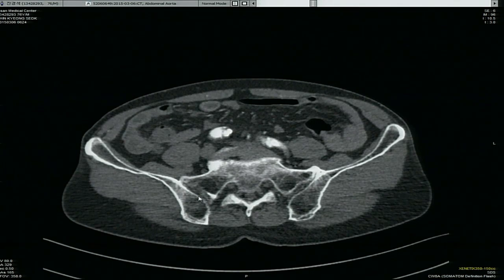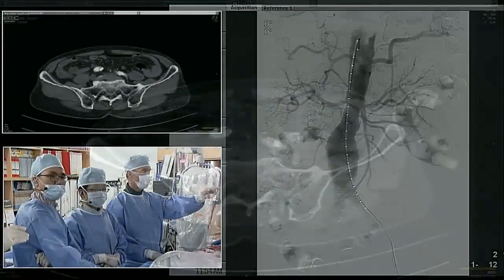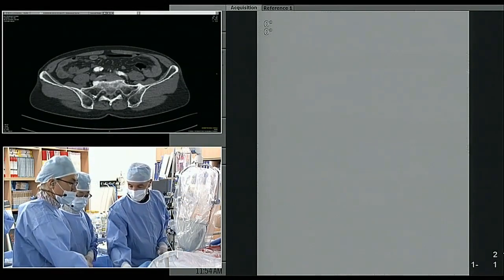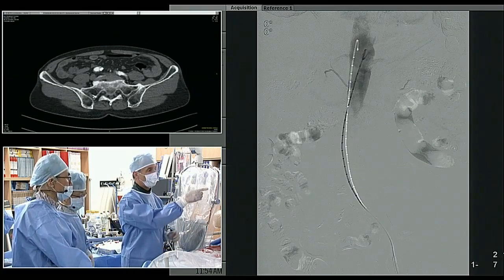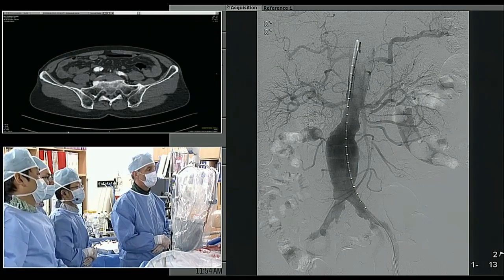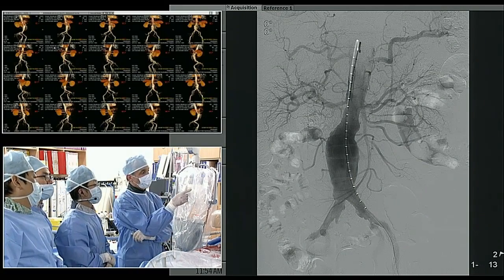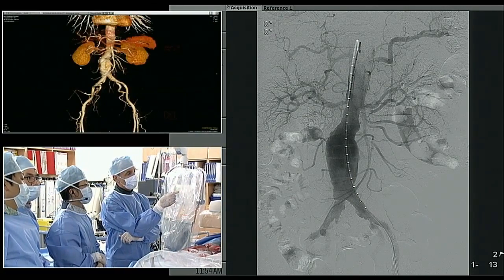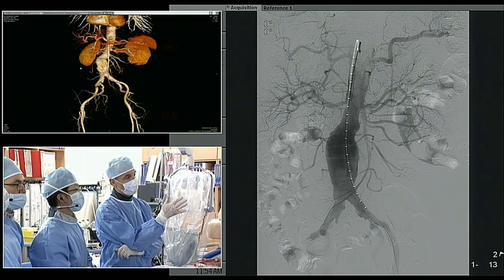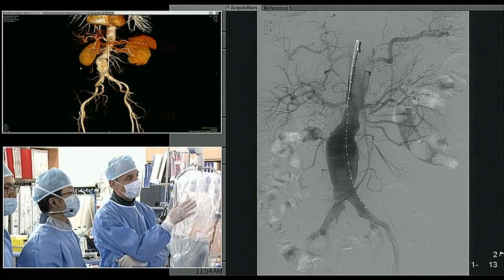Okay, let's go now to the angiography and see if you can see that. There you go. Can we stop this there? Beautiful. Okay, so Bob, you can see the marker catheter. It's at least a 3 centimeter neck. Yes, we especially see that given the size of the device that we have chosen.